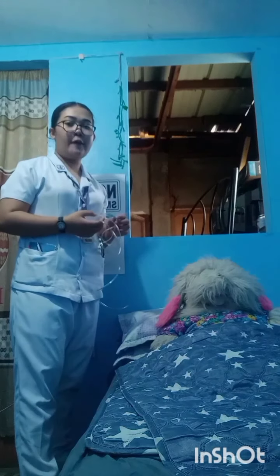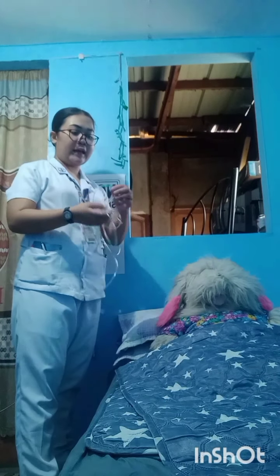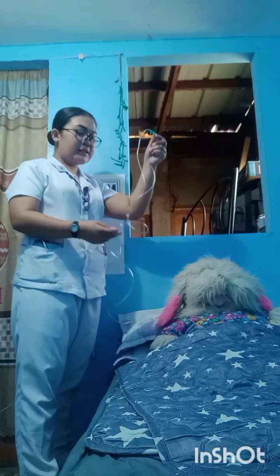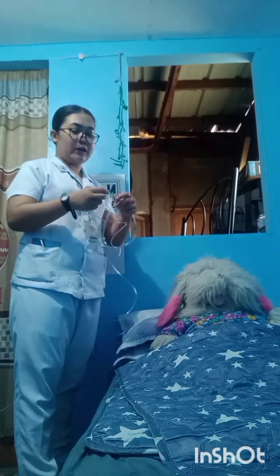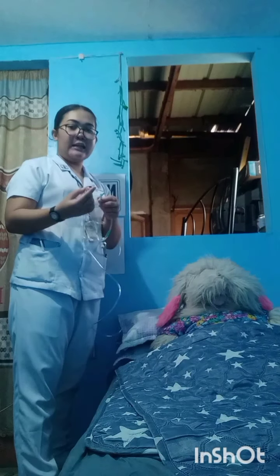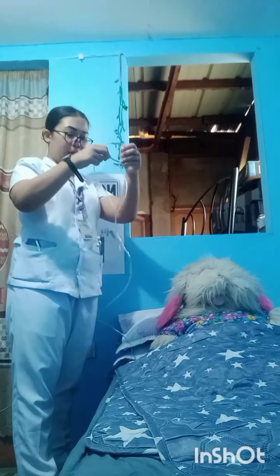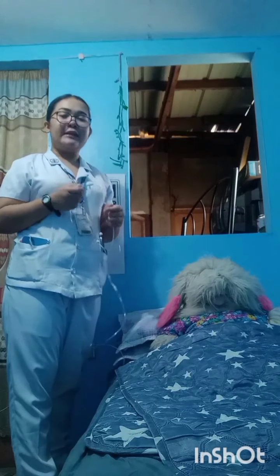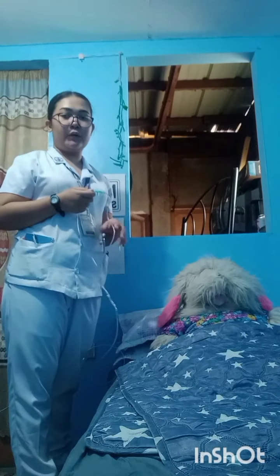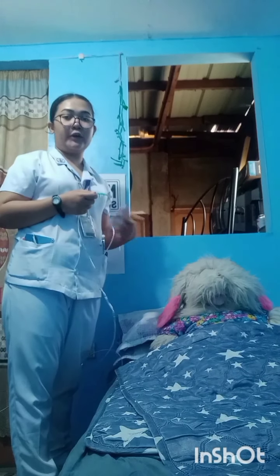Next is we're going to check the oxygen if it flows freely on the tubing. So kailangan natin malaman kasi may mga instance din na hindi siya nagfo-flow freely kasi natutupi yung tube. So kailangan natin siyang i-check. Ito. Ayan, ito. Okay. Okay siya.